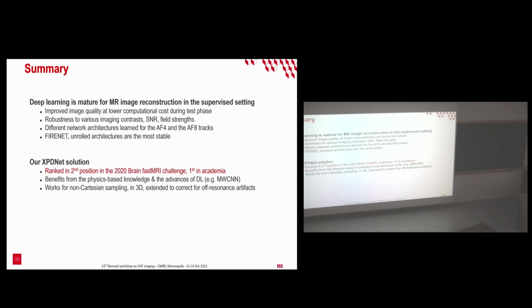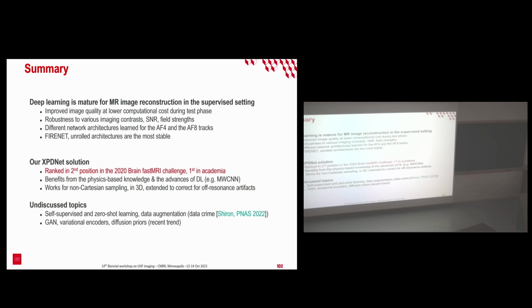So our solution, yeah, I was wrong on the time, but whatever. What matters is that the most stable solutions must be informed by the physics of the problem, okay? And can work for non-Cartesian sampling in 3D and correct off-resonance effects and so on.